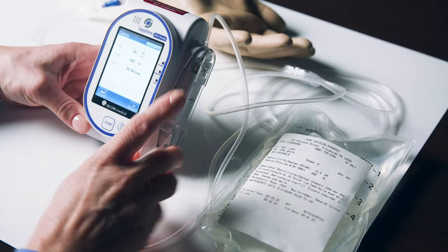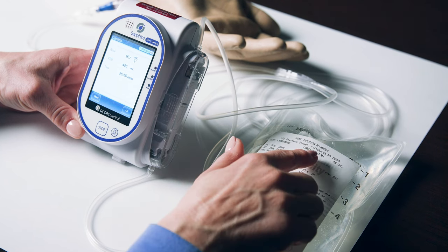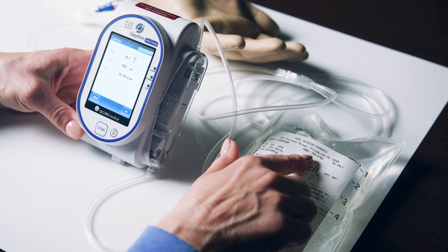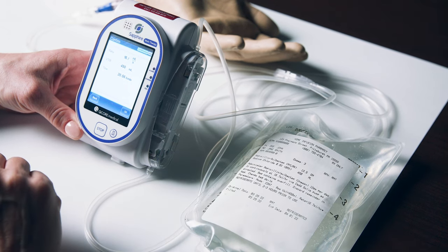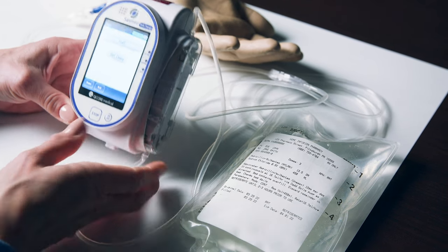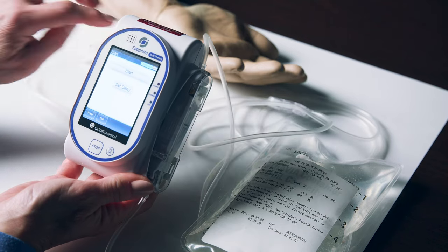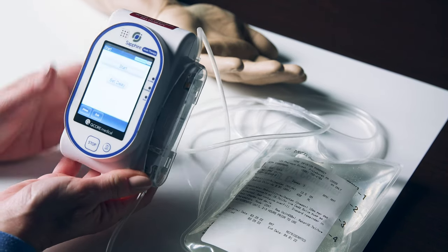When the pump parameters show on the pump screen, compare them to the medication prescription label infusion parameters. Contact your pharmacy if the pump and medication label do not match. Your pharmacy phone number will be on the top of the medication label. If the pump settings are correct, press OK. Please double check that all the clamps on your tubing are open and press Start Infusion.